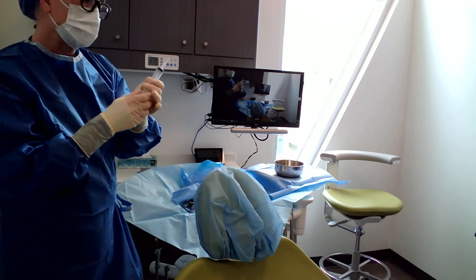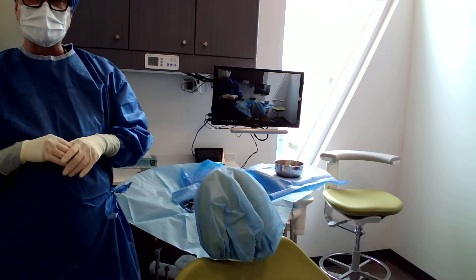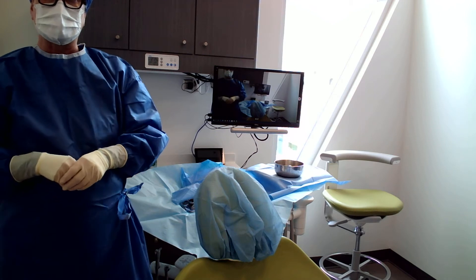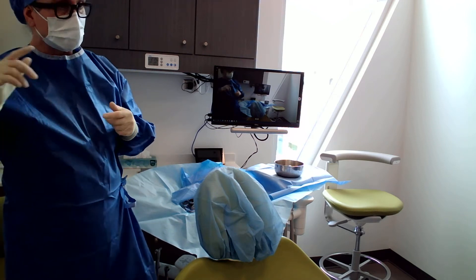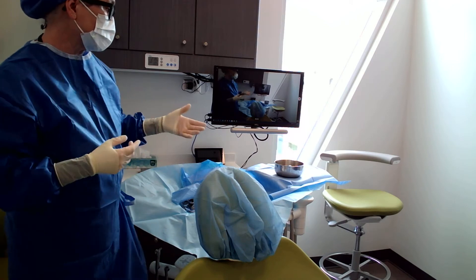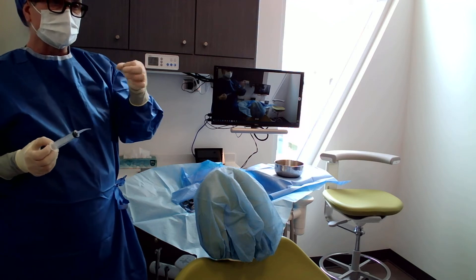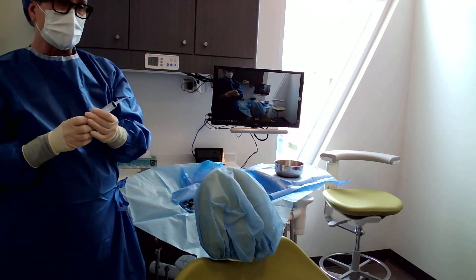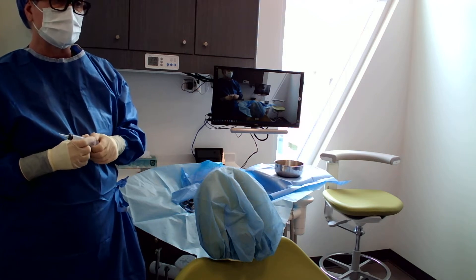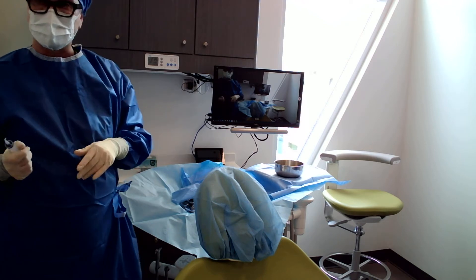Some implant handpieces and modules come with an ear where you can hang a saline bag and actually irrigate your handpiece — which is really nice because it frees up the dental assistant's hands. When we do osteotomies, which is when we're making those holes in the bone for the implant, we use copious amounts of irrigation because we don't want to heat up the bone. We have to keep everything really clean and really cool.